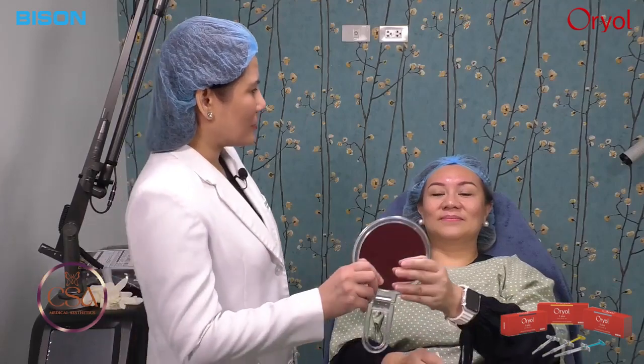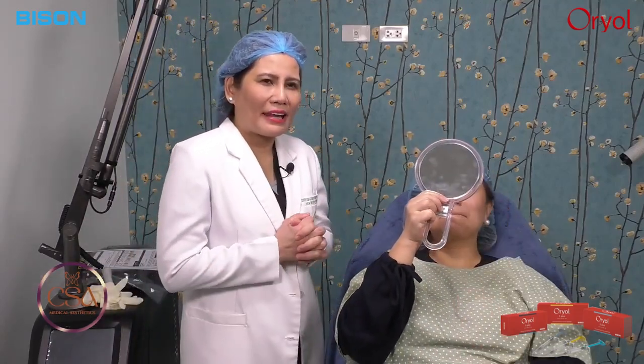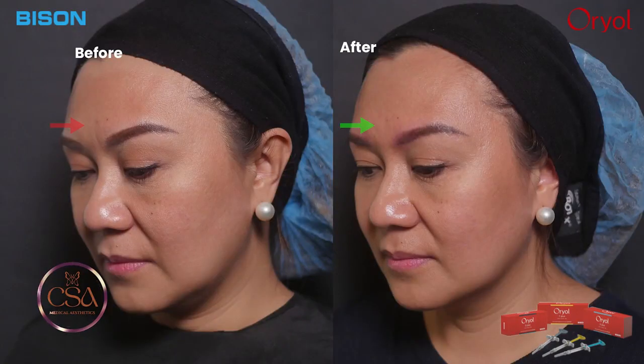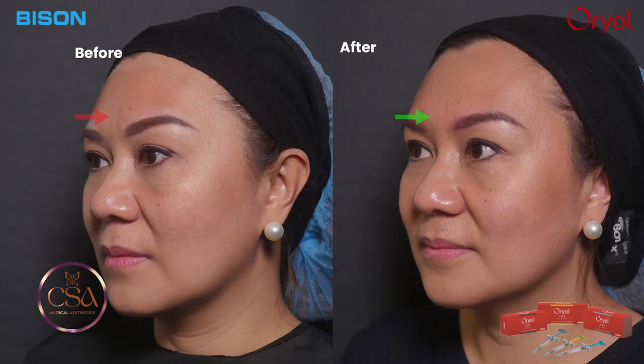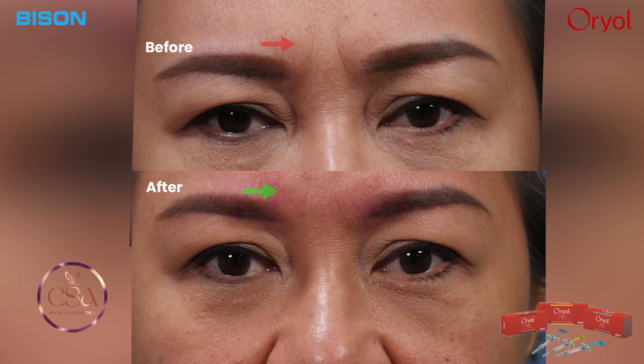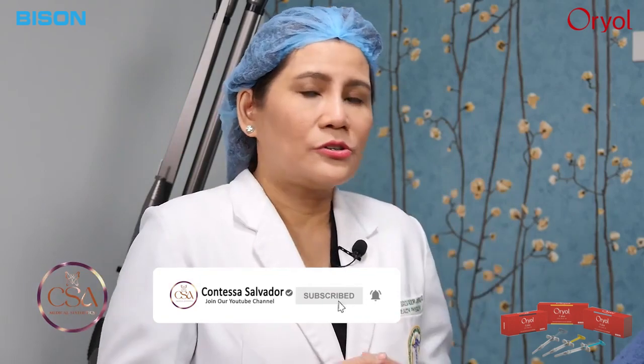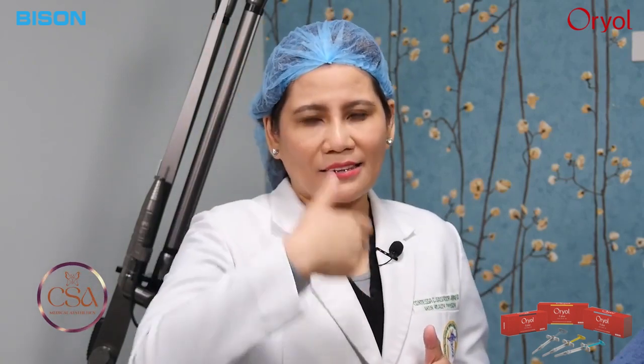And we're back, so we're about to show the result to Ma'am Maureen, and here's our mirror. So there you go. We did the glabellar lines, those 2 vertical lines brought about by the corrugator muscles and also by the aging process. So the loss of collagen or depletion of elastin and glycosaminoglycans, because over time, as we age, we get depleted of all the extracellular matrix proteins inside our dermis, inside our skin. And with the constant facial movement, those contractions of the muscles during facial expressions, they tend to create a dent, and it becomes permanent or static already, the static glabellar lines.